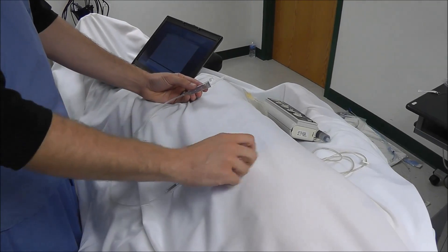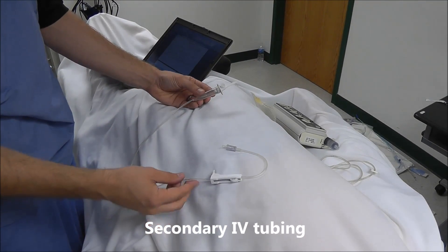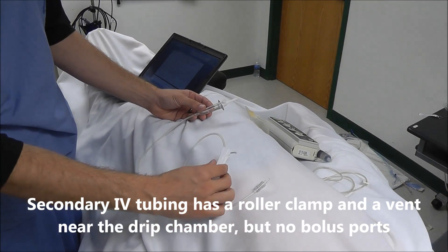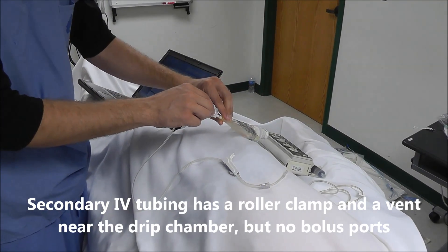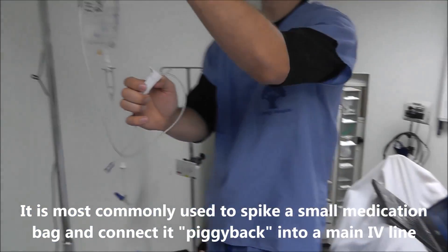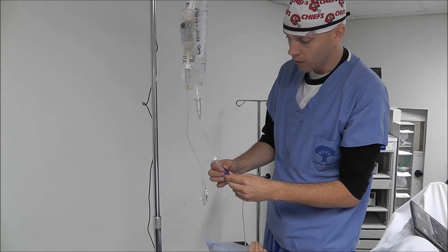The last type of tubing I want to cover is secondary IV tubing. This is very short IV tubing — you'll notice it has no bolus ports but it does have a roller clamp. The main use for secondary IV tubing is to run antibiotics piggyback into a primary IV line.